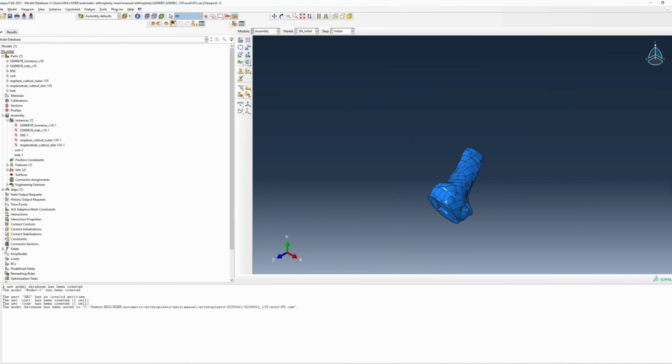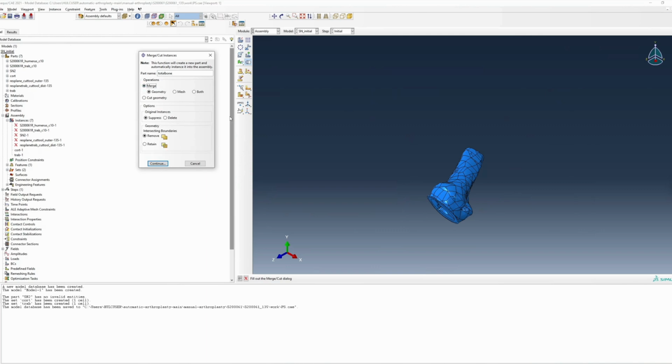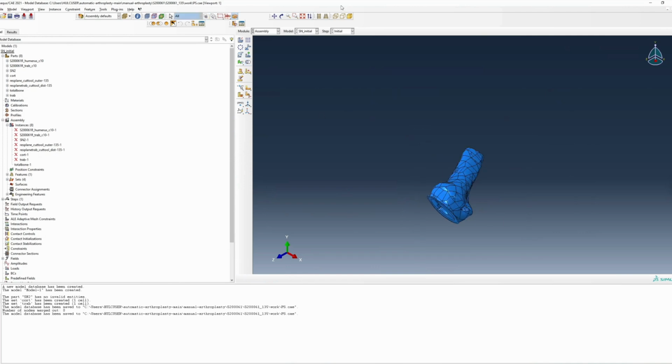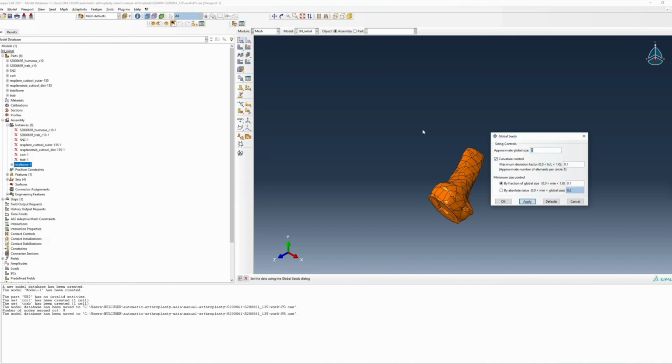After you've completed all your resections, now it's time to create a total bone model. This can be done under the assembly module, where you merge your geometry but ensure that you suppress your original instances and retain your intersection boundaries. Now that you've created your merged, resected, and finalized bone model, it's time to apply global seeds.